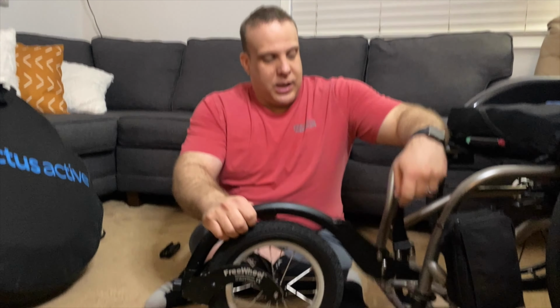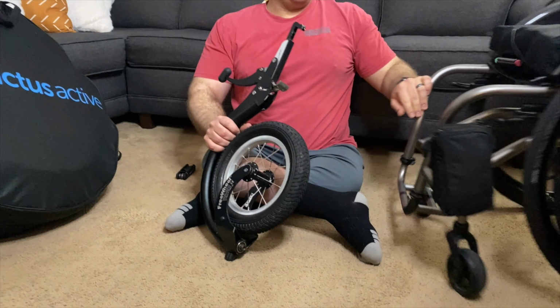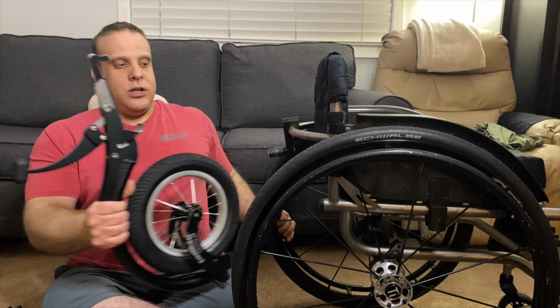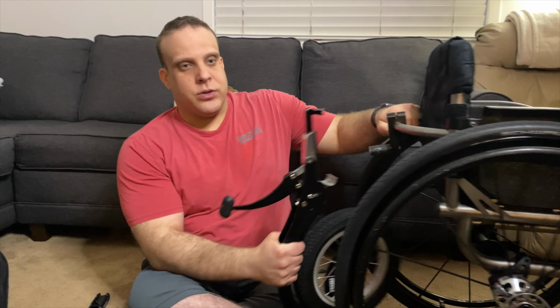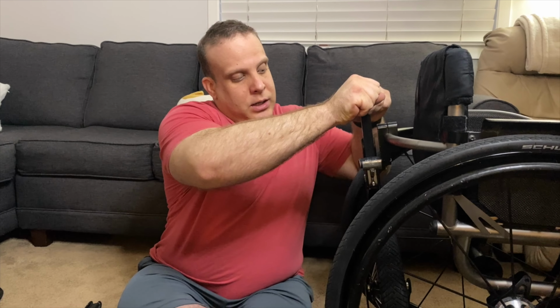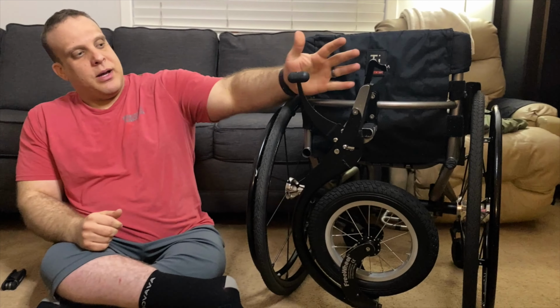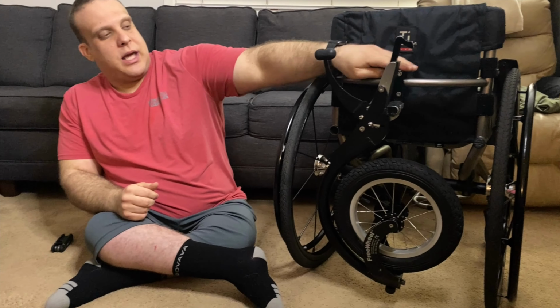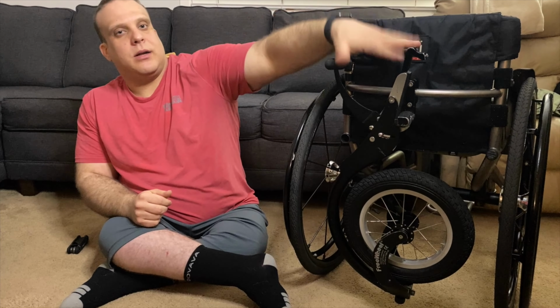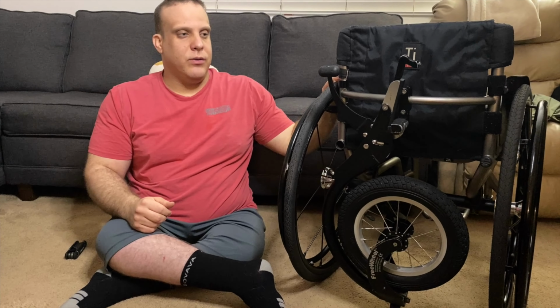And then it does come with this nice little bracket that you can put on the crossbar on the back of your chair. So when it's not in use, like if we go into a store on a trip and I don't want it hanging off the front, or when we're traveling at the airport, you quickly put it up here, you lock it on, and it's off the ground. You can adjust the angle here, but I have mine set a little bit further down so that if I'm wearing a backpack, it doesn't bump into it.